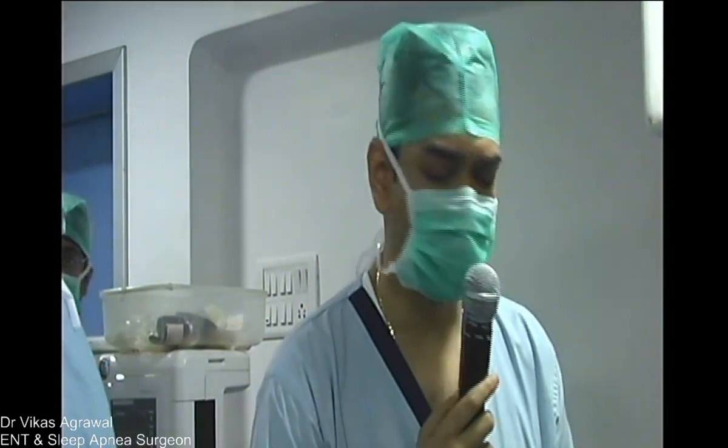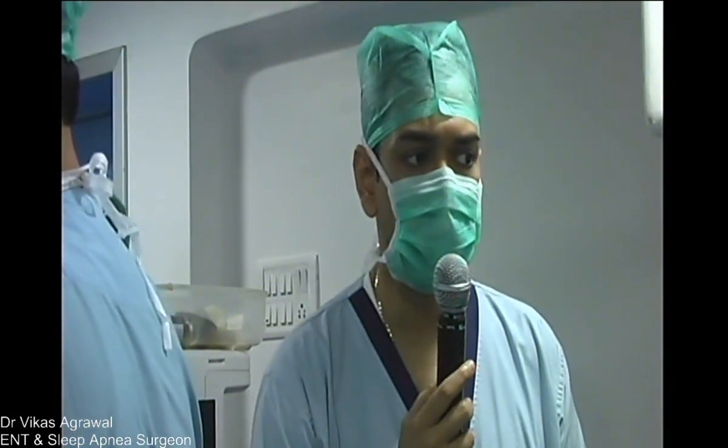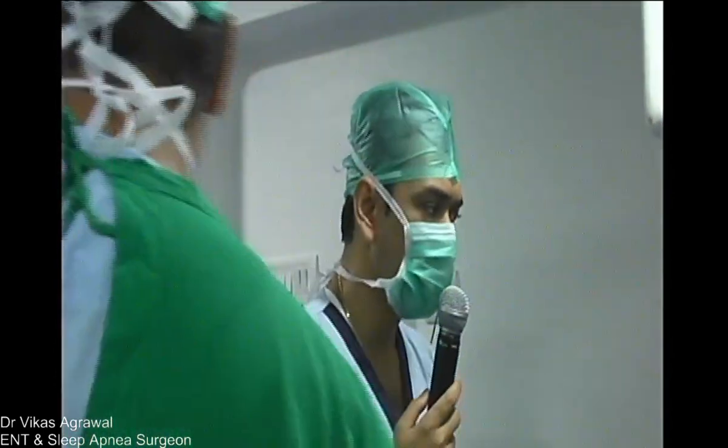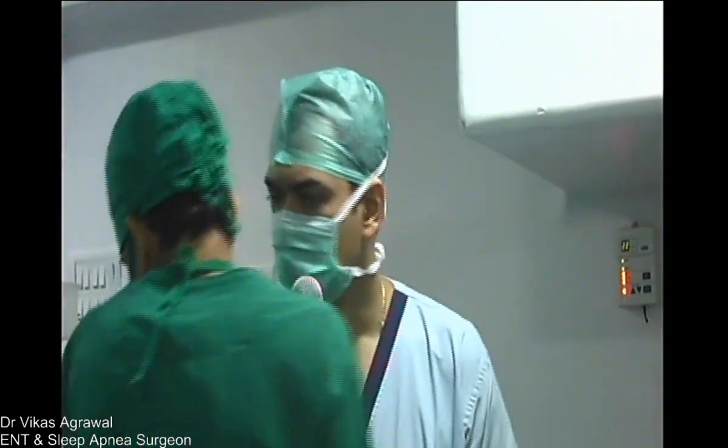However, over a period of time, as one gets more experienced, it tends to be a little more reliable. The observer variability, meaning what I would call an anteroposterior collapse or a concentric collapse, and what Dr. Vikas would call, would not differ once I have done about 50 or 60 of them. But initially there will be a lot of confusion in terms of where to place the scope, how to position the scope, and so on.